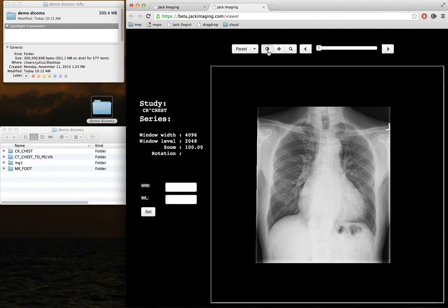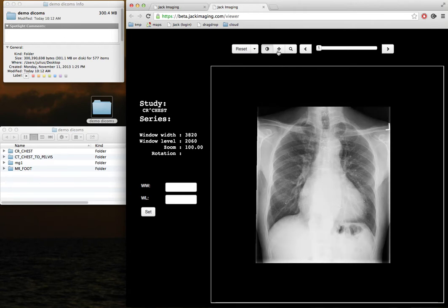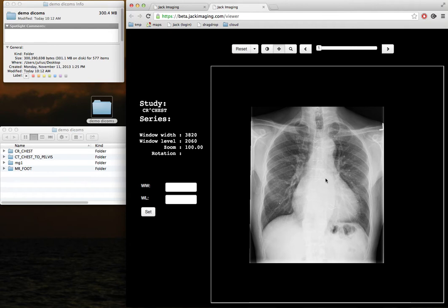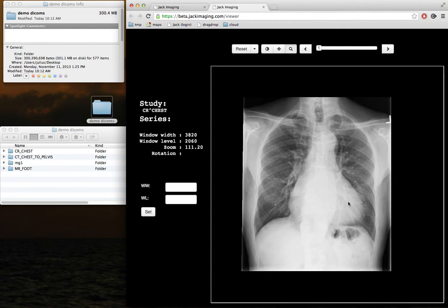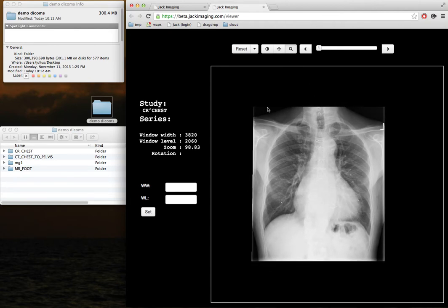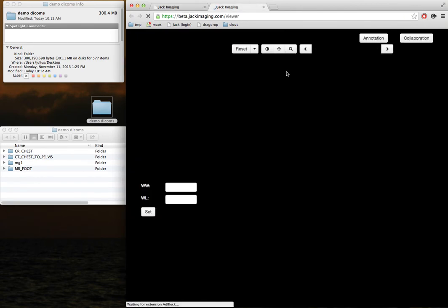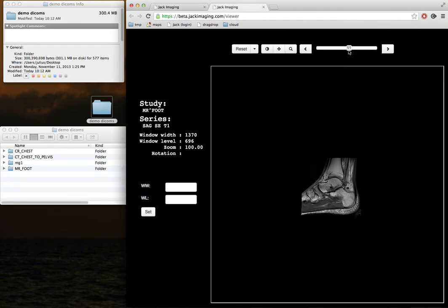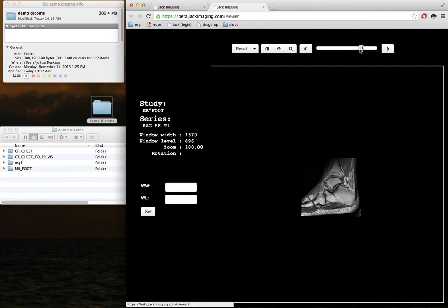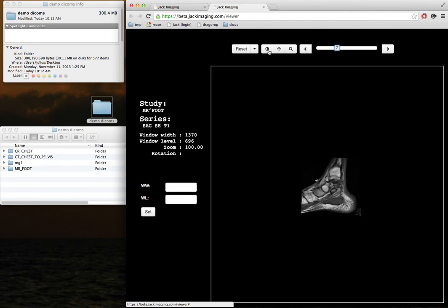Inside the viewer, you can change the windowing level, pan, and zoom. You can slide through individual images in the DICOM series.